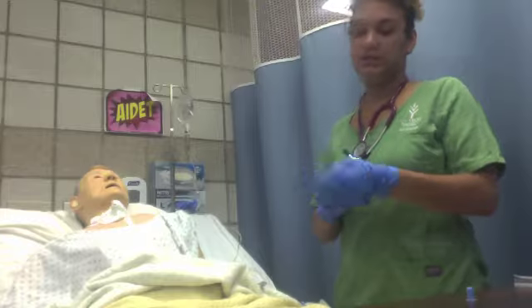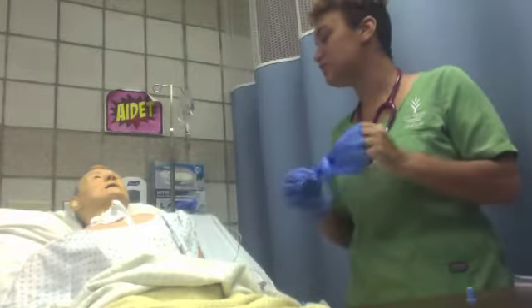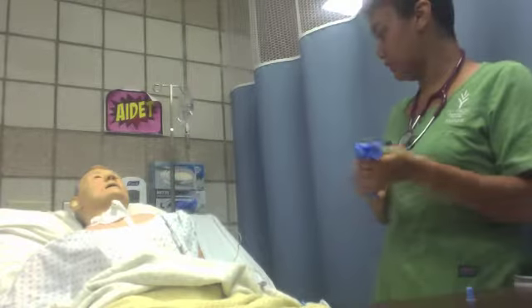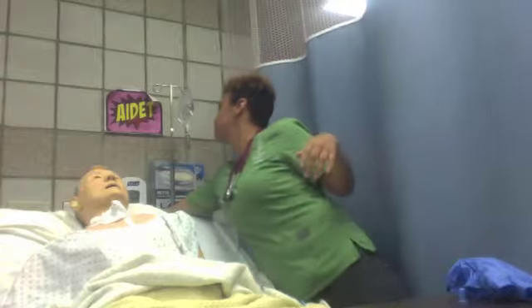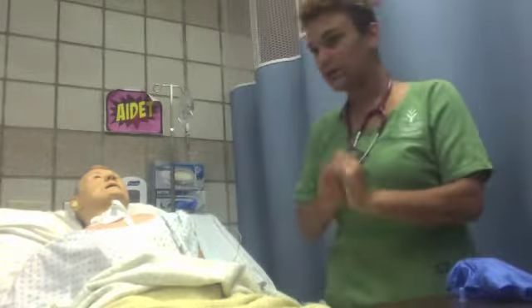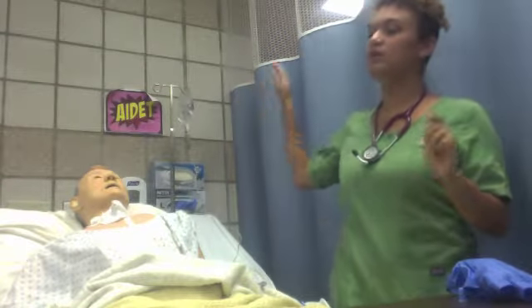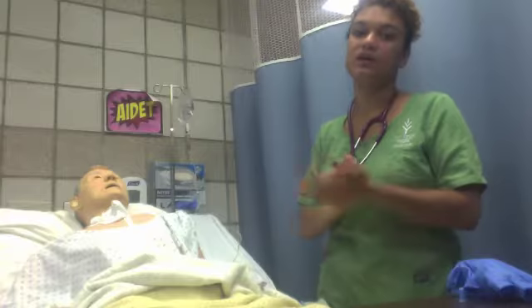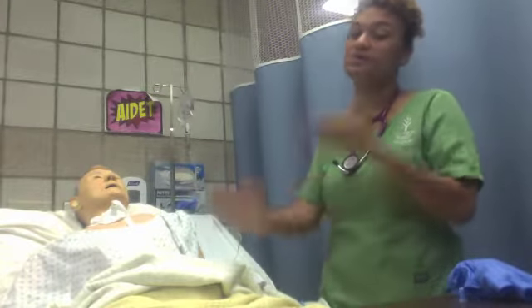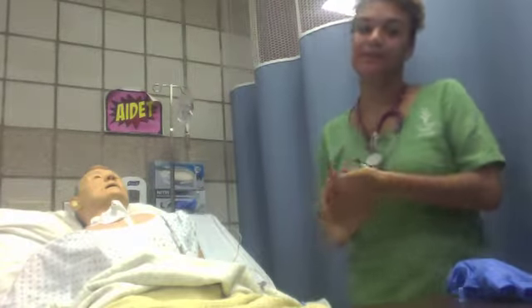All right. So now I'm going to go ahead and take off my gloves. Do you have any questions for me? No? Okay. All right. Perform hand hygiene. All right. I'm going to lower the bed and lower the head, making sure that it is appropriate height for the IV therapy, especially if it is gravity flow. And be sure to come back and check per hour, per facility policy, and per medication administration. Thank you.